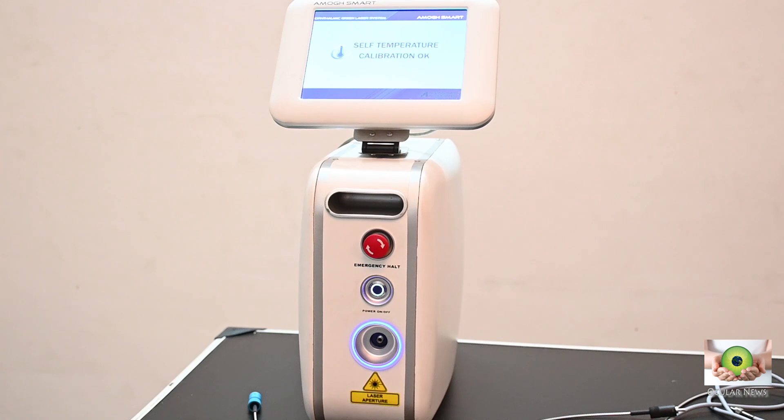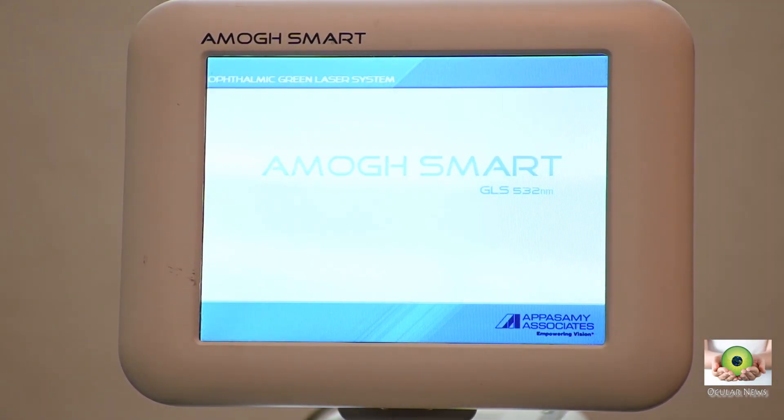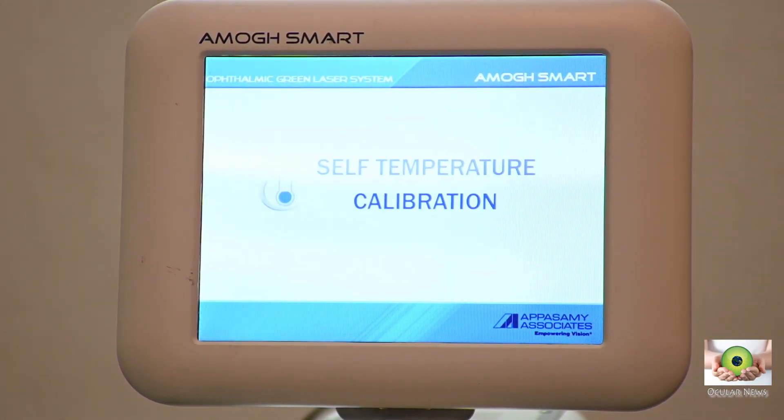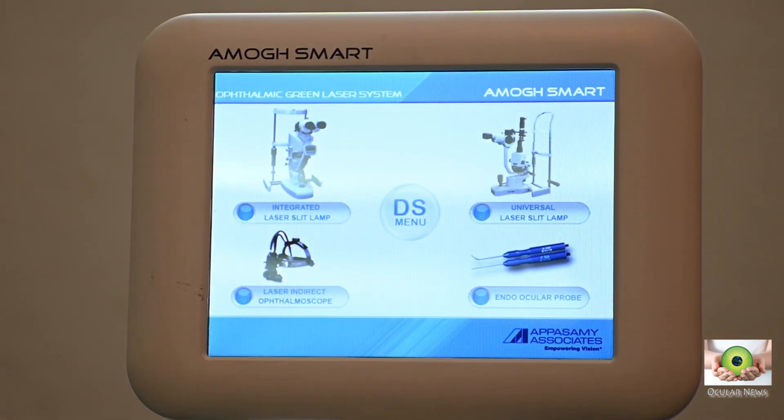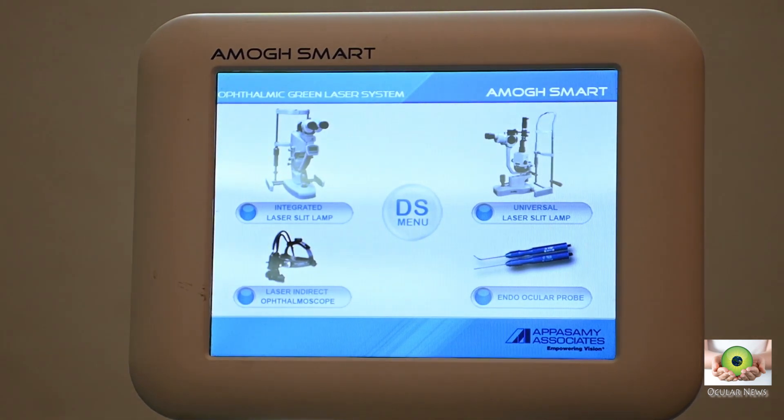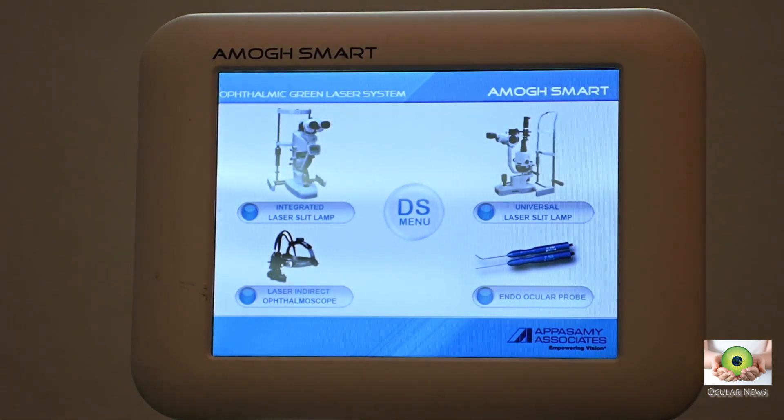This laser has a rather nice looking console with illuminated switches and ports, and even the foot switches are illuminated. On switching on, after the self calibration and temperature check, the main menu is displayed where one may choose various options for laser delivery via integrated laser slit lamp, external slit lamp, laser indirect ophthalmoscope, or endolaser.